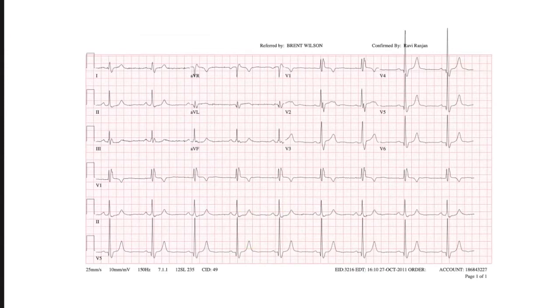I think it's about 50. About 6 boxes, and we said 5 is 60. That sounds about right. So do we think it's fast, slow, normal? A little slower than 60, but it's not abnormal. They're in shape. Maybe they're an athlete or something.